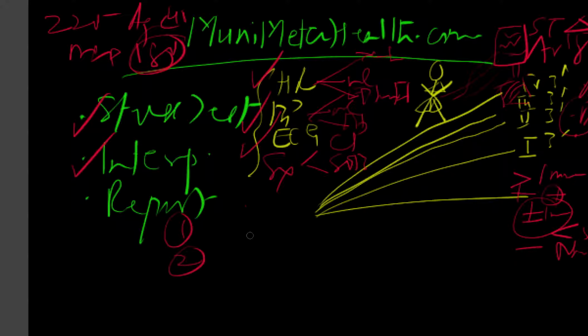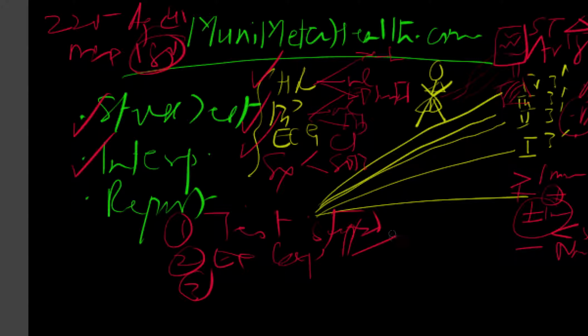Two, you will say the exercise capacity was average, below average, or above average. So you say the exercise capacity, very important. Why the test was stopped, the first reason. So test stopping, or the limitation of the test, either because of the exaggerated response, the blood pressure response, or the ECG response, or the symptom response. So you have to define that. Show the exercise capacity on that individual. Why? Because you need to say whether it's below average, it's average, or it's above average.